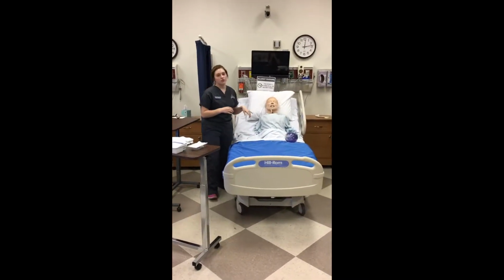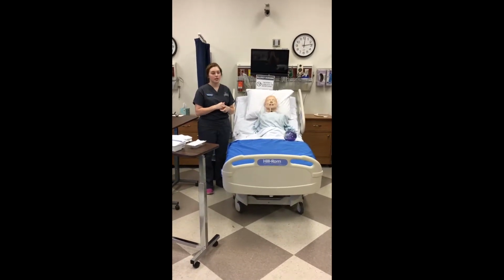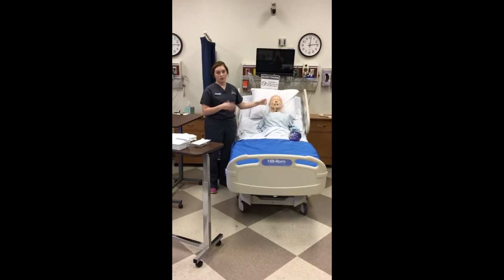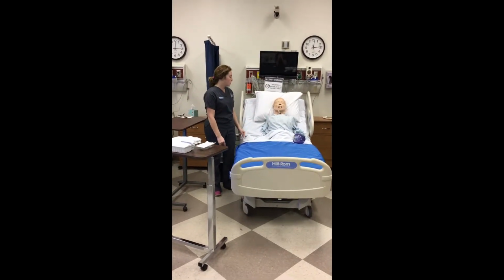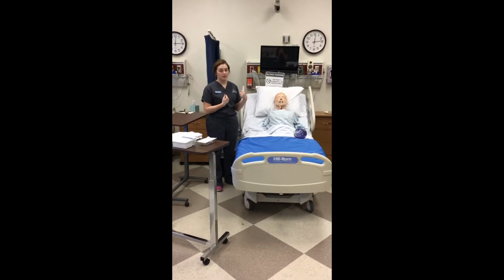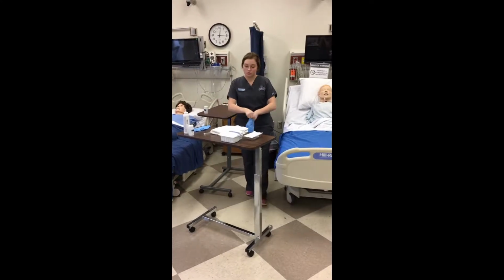Next, you're going to want to assist your patient into a semi-Fowler's position. If they're conscious, you want to turn their head towards you. This model's head doesn't turn, but ideally that's what you would do. And if they are unconscious, you want them laying in a lateral position facing you. So now I'm going to go ahead and put on my gloves.